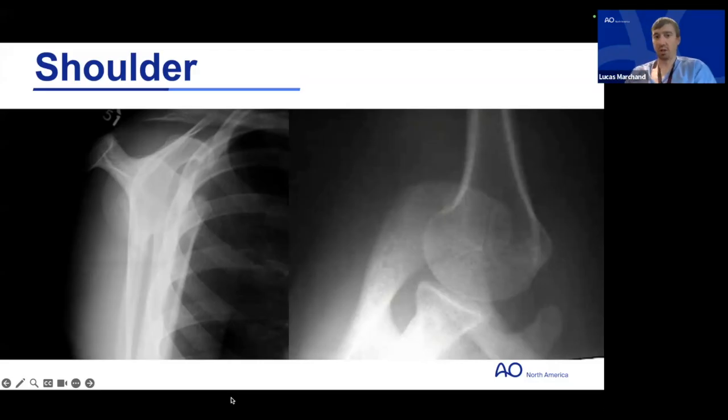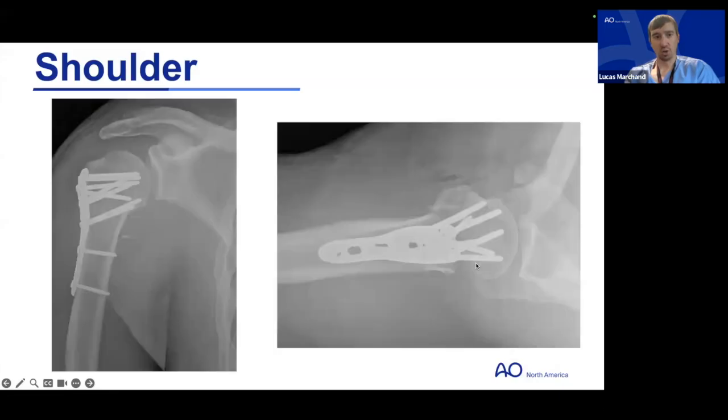Yeah, I totally agree. Times where you're worried about associated injuries that you know have a prevalence with whatever fracture you're evaluating, or there's frank joint involvement that you're trying to get better detail on. Those are kind of two primary reasons why we're adding CTs on. Here's a look at the humeral head again on this axillary lateral and the tuberosities. Just want to point those out for you guys.